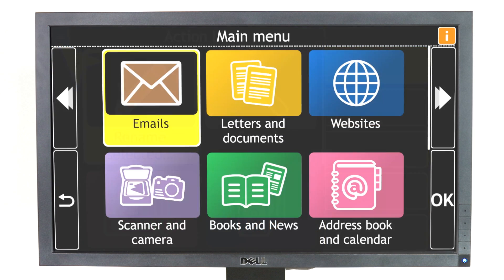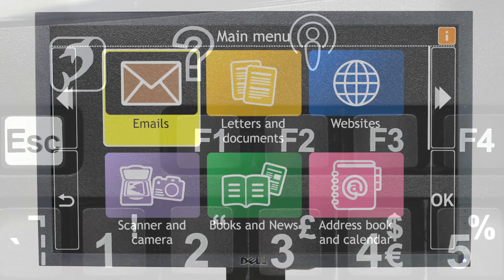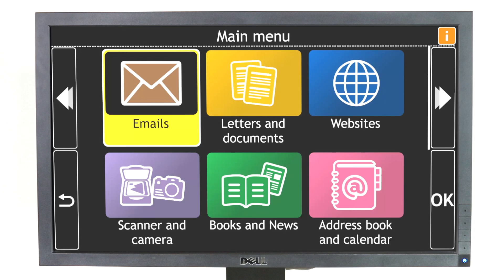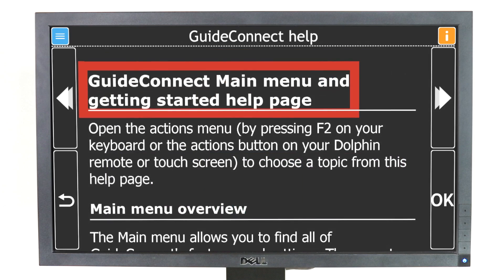There are two ways to get help in GuideConnect. Press F1 on your keyboard for help for the feature you're currently using.